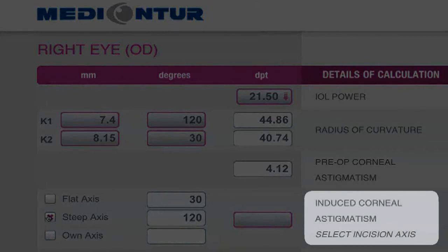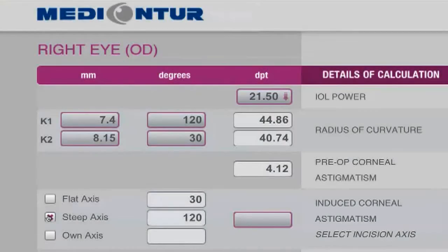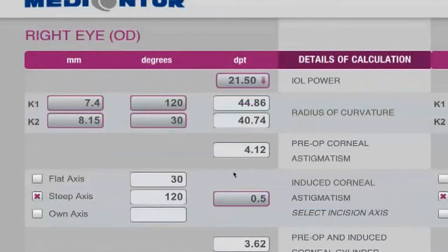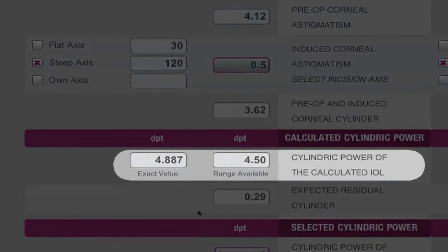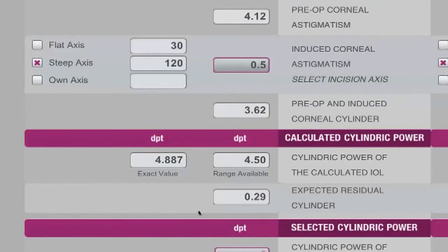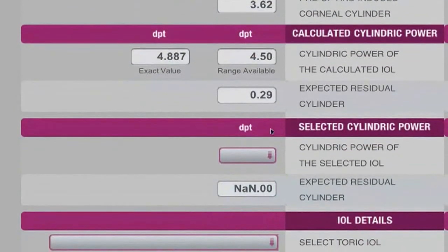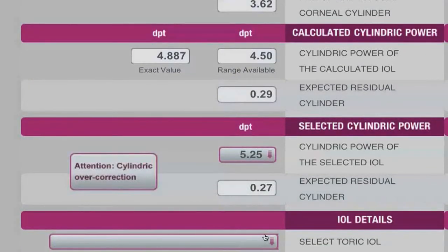The Metacontour online calculator offers, while determining the steep axis, the option of taking into consideration the induced astigmatism during the surgery. After entering all the required data, the highest correction to be used automatically appears in the range available. At that stage, you get the opportunity to select the real value of the cylindrical power. As overcorrection is to be avoided, the calculator displays a warning message to not overcorrect.